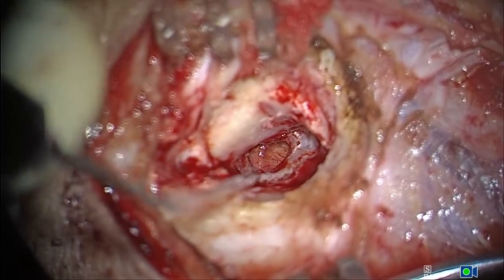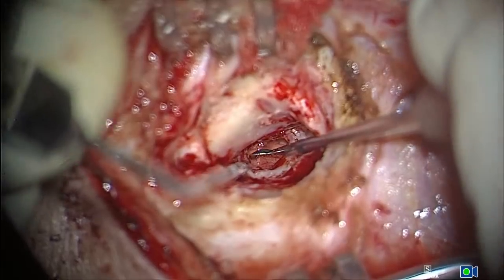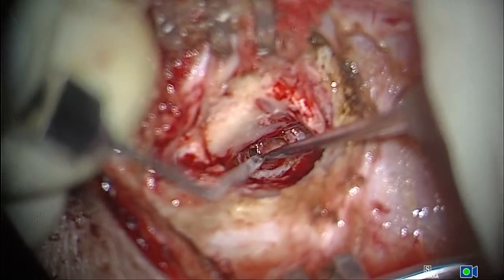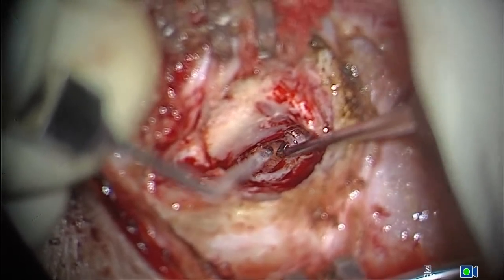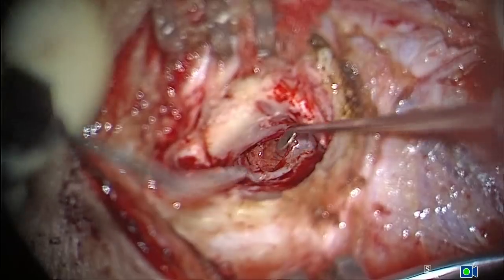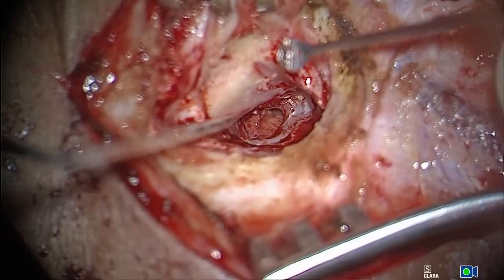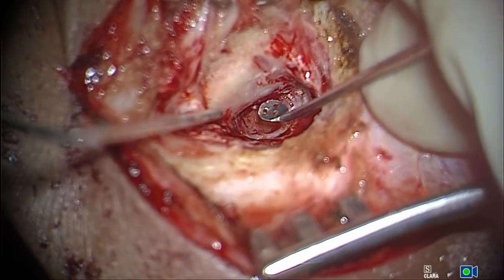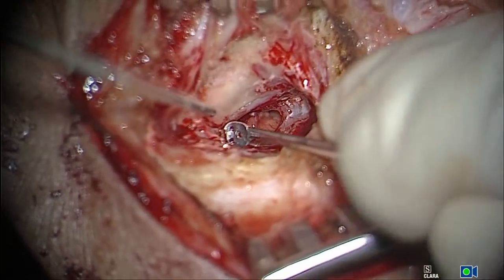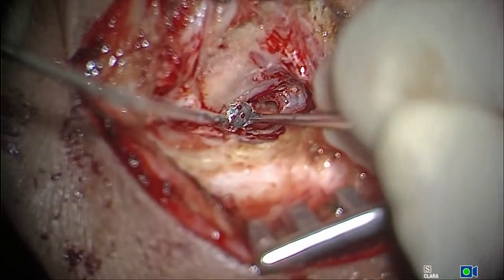Now give me the plasters. So having freshened the margins, I'm going to raw the under surface of the perforation. This side you have the malleus. Okay, perfect. So I have done that now, and I'm going to make that incision now. So what kind of incision am I going to do? I'm just going to make an incision from here. So this will be something like a 270 degree elevation of the flap. So that's the first incision I make.